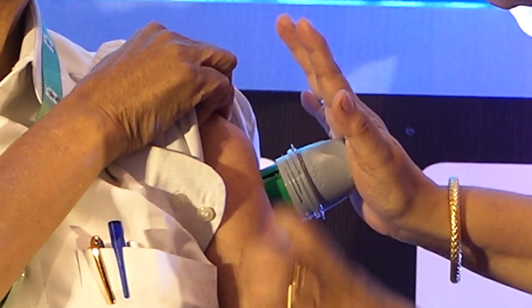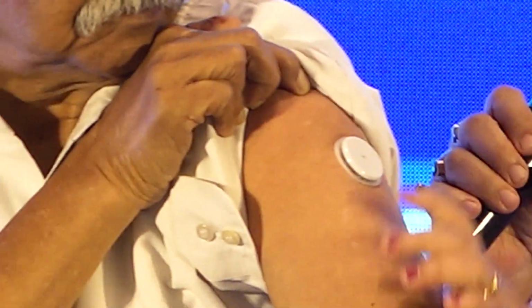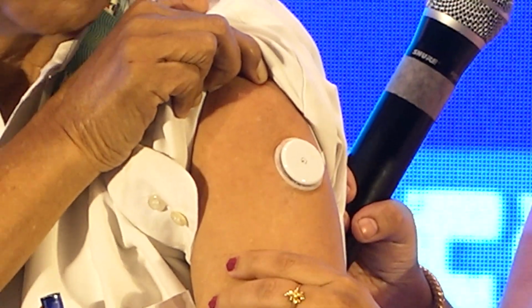In this manner. So this is the sensor. It's stuck on. There is a sensor, a platinum chip, and there is a capillary which has been pushed in. Did it hurt a lot, sir? No. Okay, fine. Not yet. It will not be painful. The only thing, this is secured, but preferably we give another micropore to give it protection. And he can wear it 24 hours of the day. He can bathe, he can go to the gym, nothing will happen. The only thing is he should not give a blow on it. Don't bump it against the door.